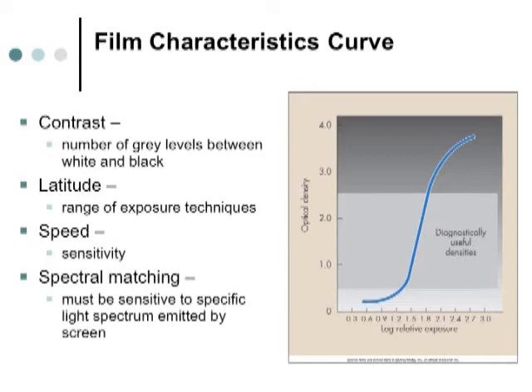5 mAs, you're way out of the ballpark. Less than 1 mAs, you're way out of the ballpark. So the faster the system, the narrower your latitude is, your range of exposure is. But when we look at this scale, this has 4 decades. Sorry, this is logarithmic, so this is 10, 100, 1,000, and 10,000. So the range that we're looking at is about 100 to 1,000 shades of gray.